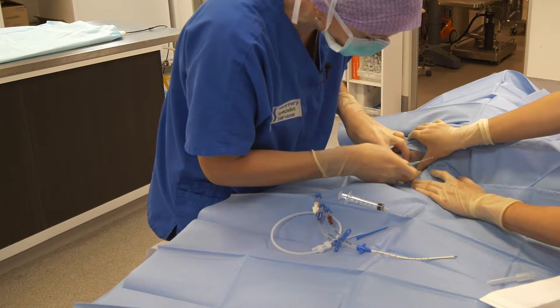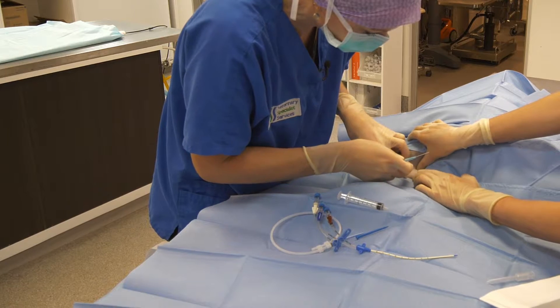We're going to place our catheter into our jugular vein — just hold that skin down a little bit there as well.